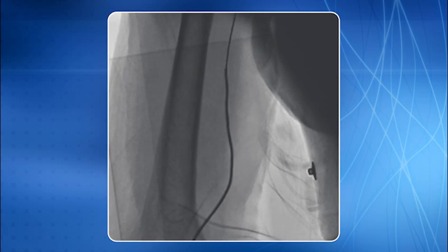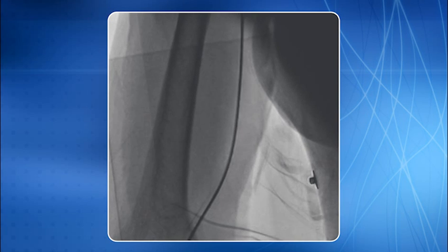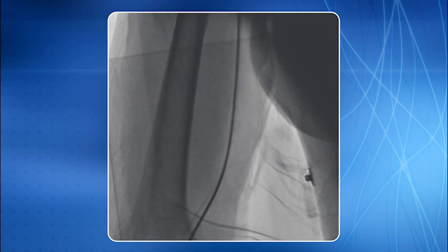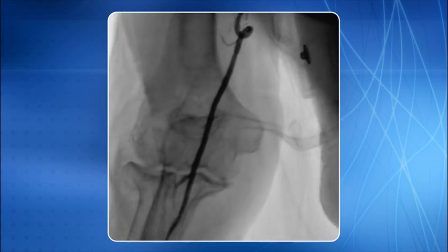Both the guide wire and catheter are now carefully pulled, which unfolded the loop. You can see the beautiful demonstration of this technique. It is worth remembering. Once the procedure was done, we documented the loop while coming back. This is an example of most challenging loop.